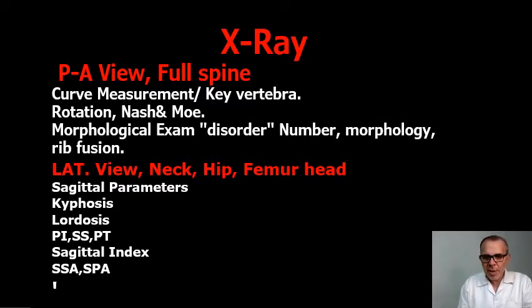On the sagittal parameters, of course, we check the patient's kyphosis and lordosis. We put in our pelvic incidence and sagittal measurements, and the sacral slope, and all these main parameters on the sagittal profile, for the importance of the follow-up on the sagittal profile in any scoliotic patient.